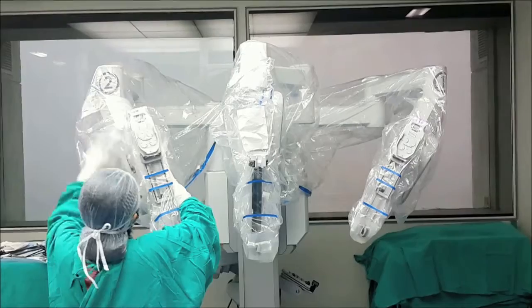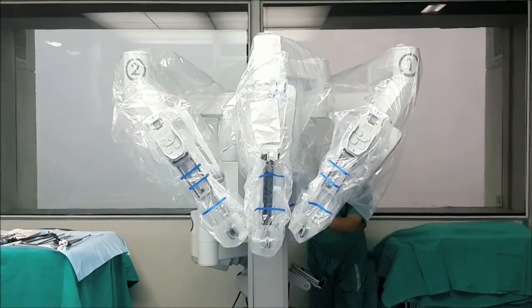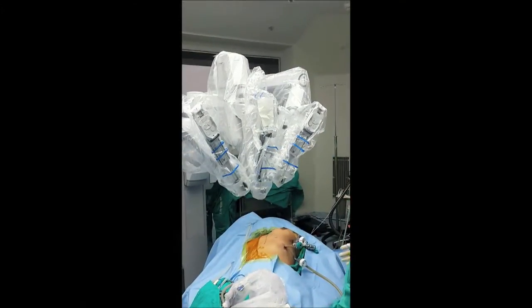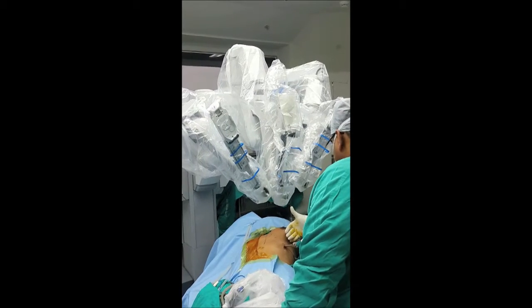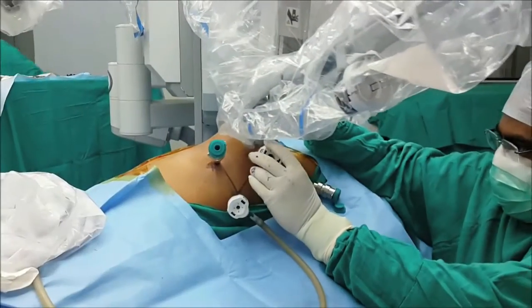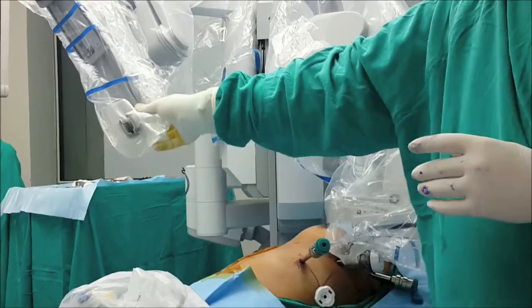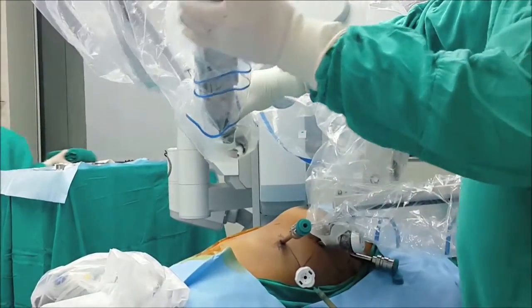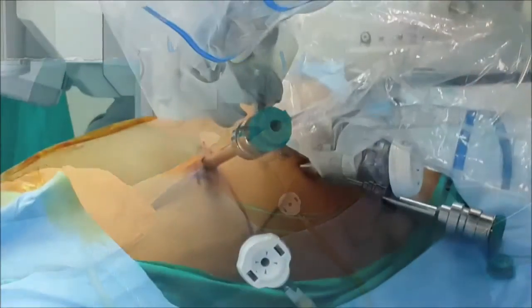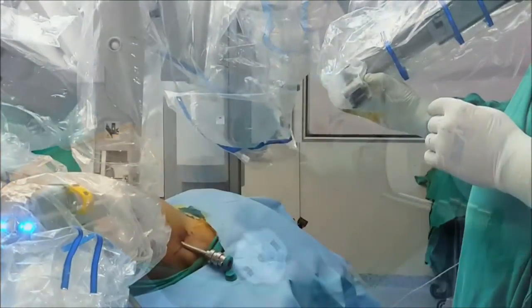When you start the process of docking, prepare the robot first — align arm one and arm two accordingly with both numbers facing towards you, then move them up as much as possible. The docking starts from over the patient's right shoulder, in line so that the camera, the target anatomy, and the central column are in one straight line. The camera port is usually the easiest to dock. These other ports are a little tricky when you start your robotic program, but once you align them well with the port they pop in easily and just lock. It takes about two minutes — not more than that.